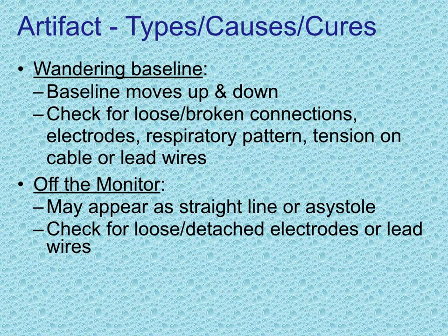Here's a couple of others. There could be a wandering baseline. This is where the baseline is moving all around. Oftentimes this is a loose cable or a bad connection. It could be respiratory in nature, but it can be quite difficult then to decipher your regular rhythm. And then you could see the patient drop off the monitor, which could then appear like asystole or a flat line, and that would be something that you definitely want to verify, that your patient is indeed asystole without a pulse before you take some actions.